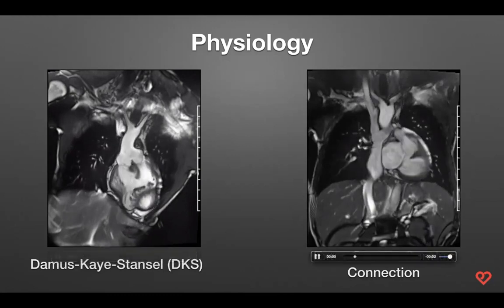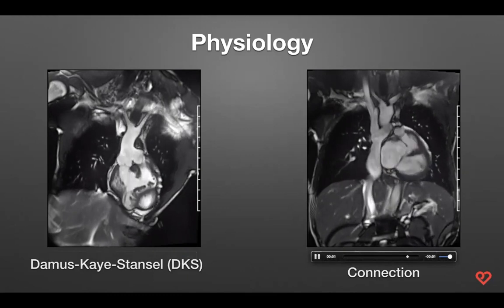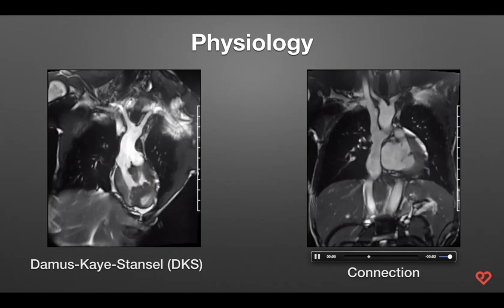Here you see how we're getting blood flow back into the pulmonary vasculature. You see the IVC coming in through the liver, and this is your Fontan, which is anastomosing to your PA, and here's your SVC coming down to your PA. This is an extracardiac connection.